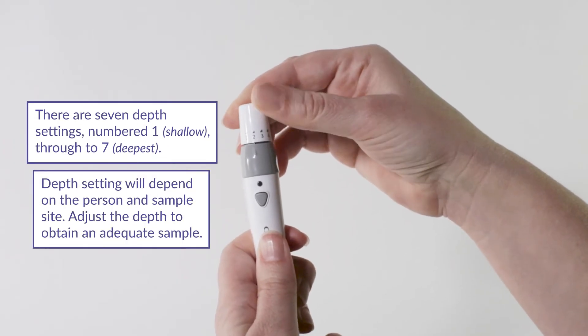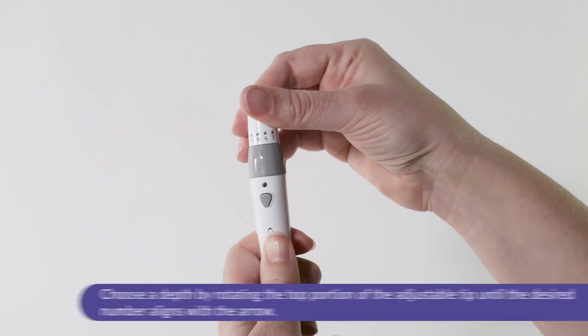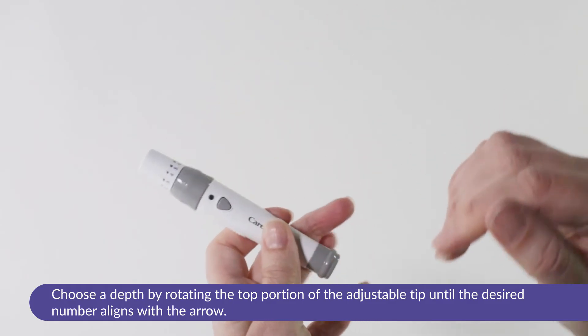The depth required will vary and depend on the person and sample site. Adjust the depth to obtain an adequate sample. Choose a depth by rotating the top portion of the adjustable tip until the desired number aligns with the arrow.